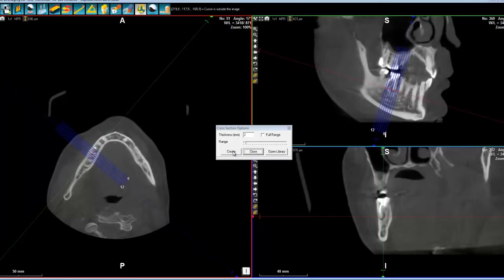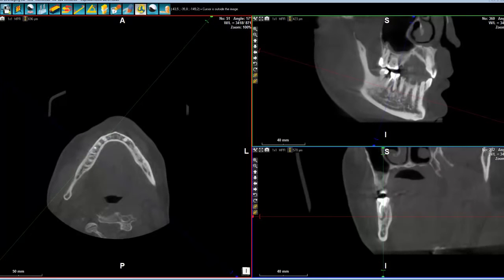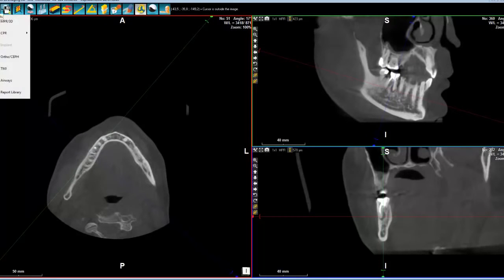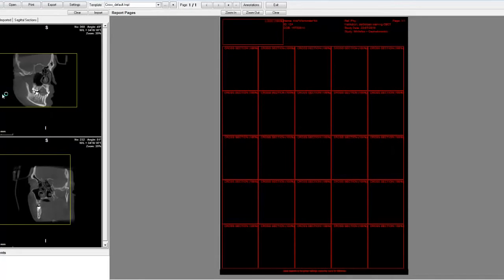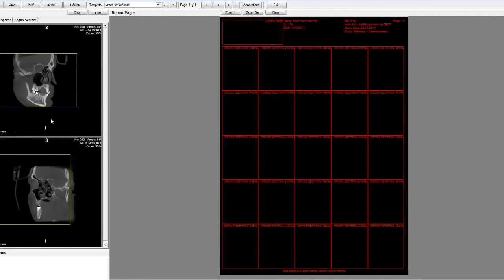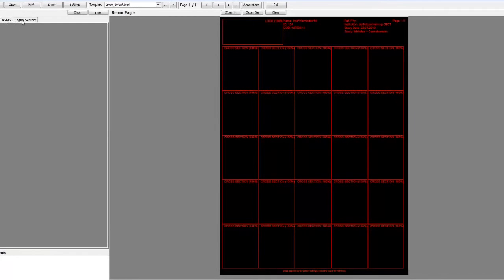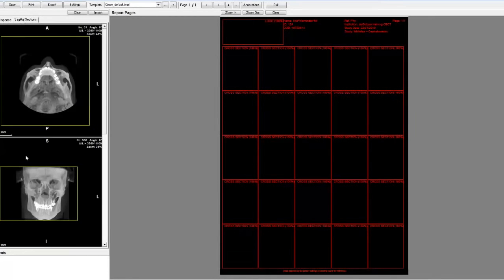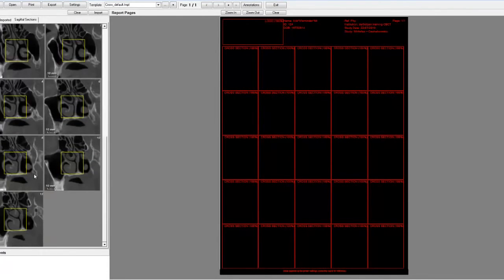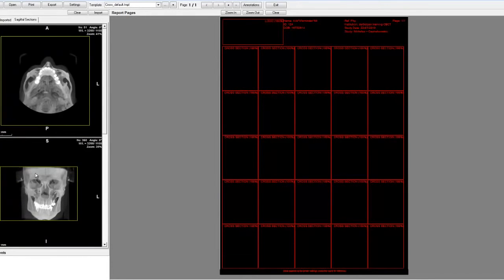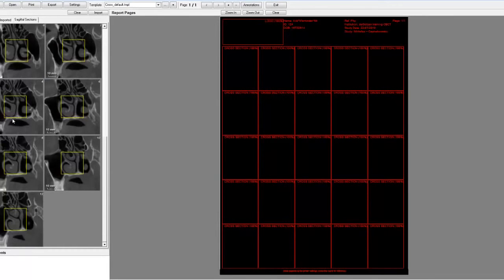And that enables me to be sure that I've got all the images I need. I will close now. I could go directly to the library, but I wanted to show you how you could reach it. You could reach it like this. Simply on the last one, because it's supposed to be the last one that you do before closing a case. And then the space is divided in two. You've got here your images that you've been storing during your diagnostic.